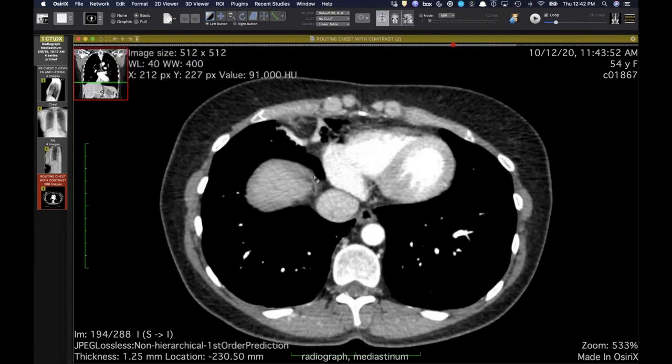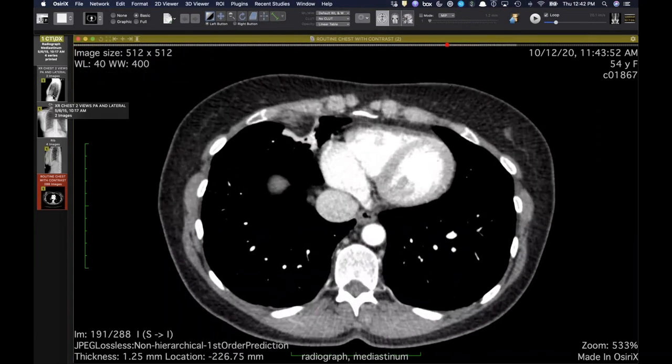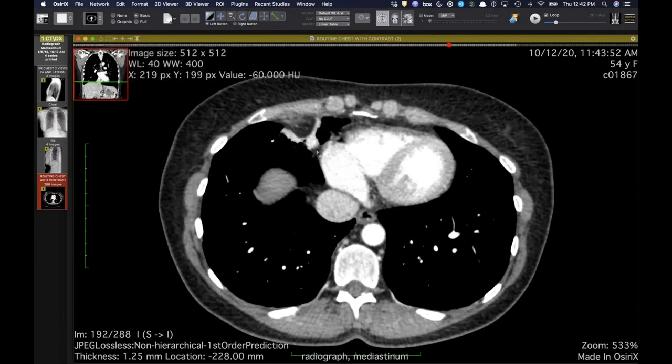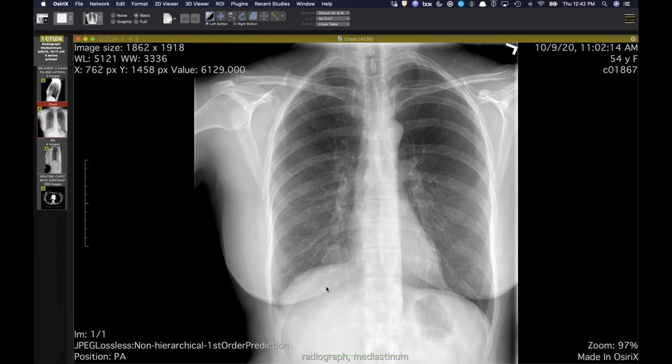Yeah, and I think you see it on the radiograph because of the atelectasis around it. Yeah, that may be true. It's getting to that right heart border, the tangent that you should be seeing. That's a great call. So I will stop there, Jeff. All right. Thanks, Travis.